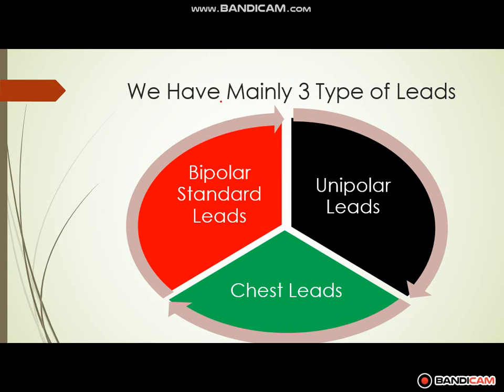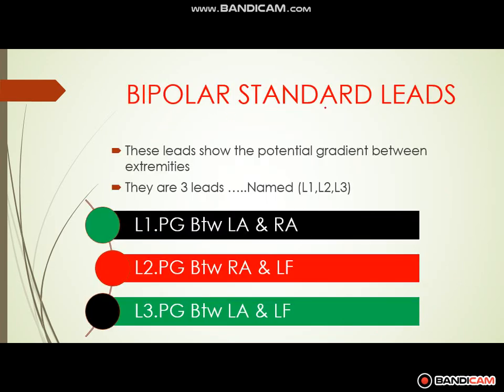We only need to know how many leads we have, how we can use them, and what the function of these leads is. So first we will explain, in red color, the bipolar standard leads. What are bipolar standard leads?